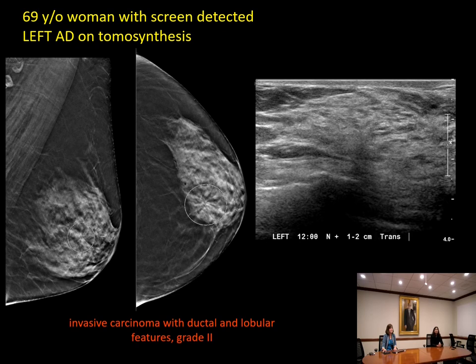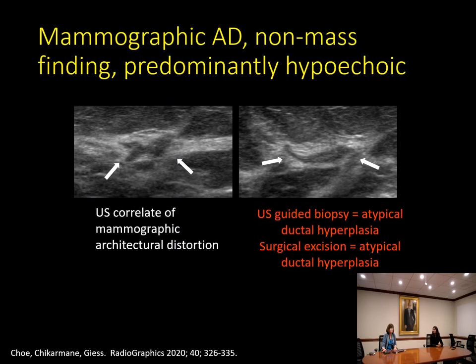Here's another example of tomo-only left architectural distortion detected on screening mammography with a very subtle hypoechoic non-mass area on ultrasound. Ultrasound-guided biopsy demonstrated invasive carcinoma with ductal and lobular features, grade two. Another example shows mammographic architectural distortion with a predominantly hypoechoic non-mass correlate shown in two orthogonal images. On one view it's a nondescript oblong hypoechoic area, but seen orthogonally it's a true three-dimensional correlate. This represented atypical ductal hyperplasia on both core biopsy and subsequent surgical excision.